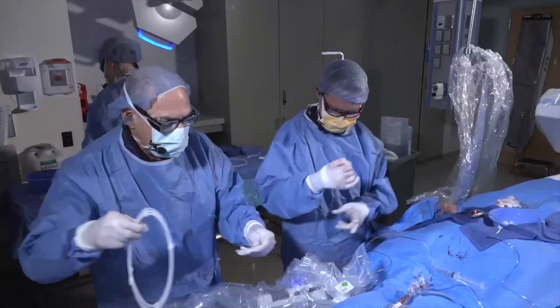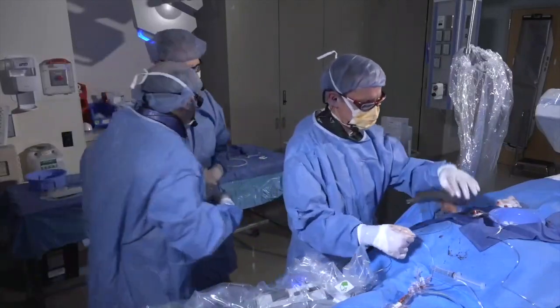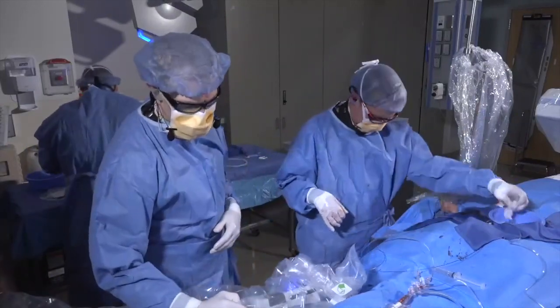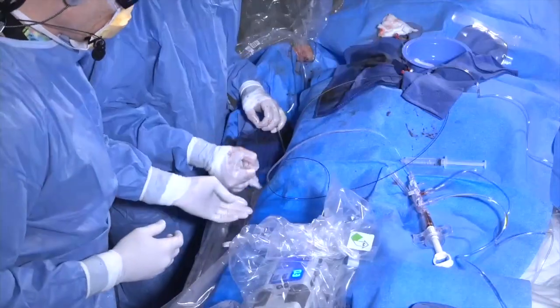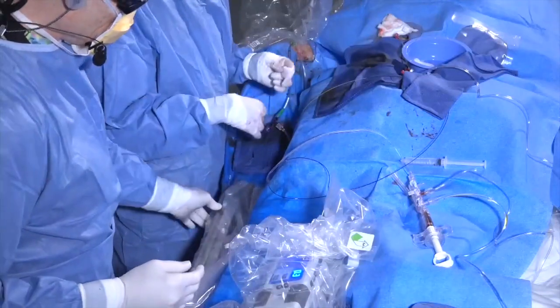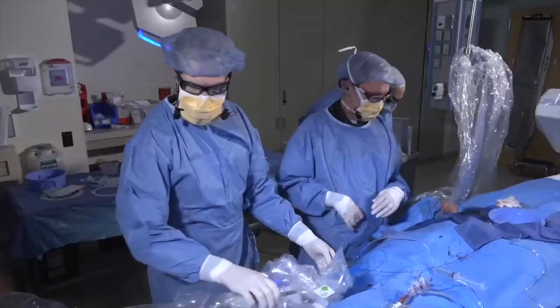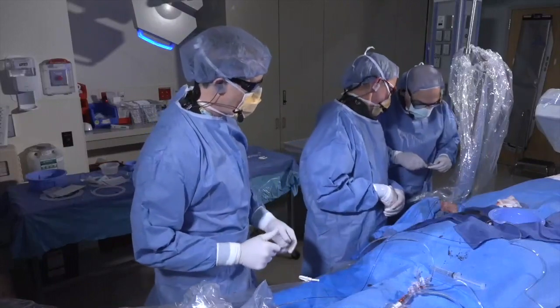And now your setup here, you did it through a 6 French radial or a 7 French radial? What did you use? 6 French radial, 6 radial for both of these cases. And minimizing complications that way, I think, is pretty important. Some would say, oh, for rota you need 7. You don't. Anything up to a 1.75 burr, depending on the guide you use, you can do through a 6.